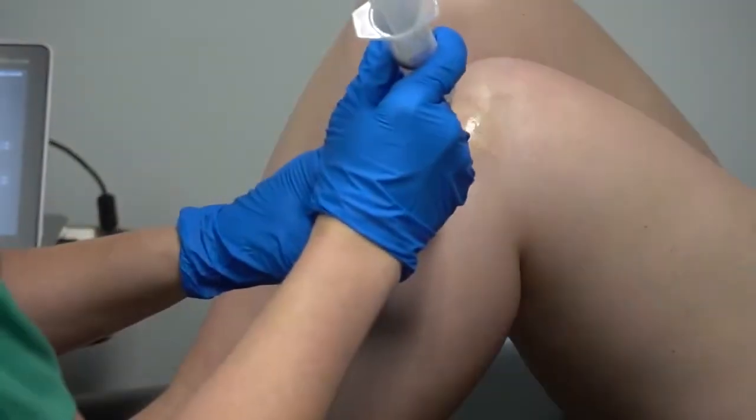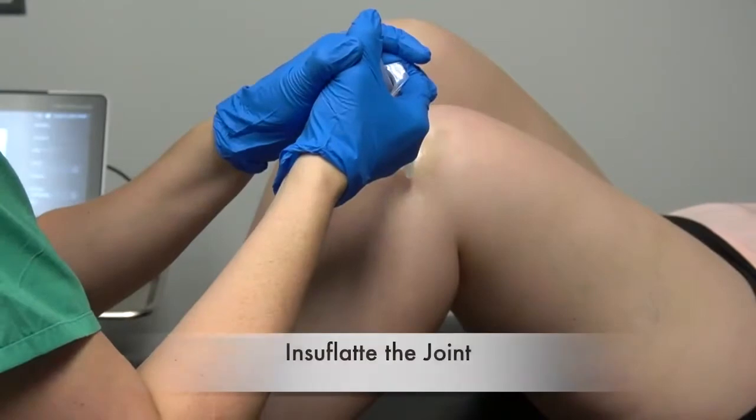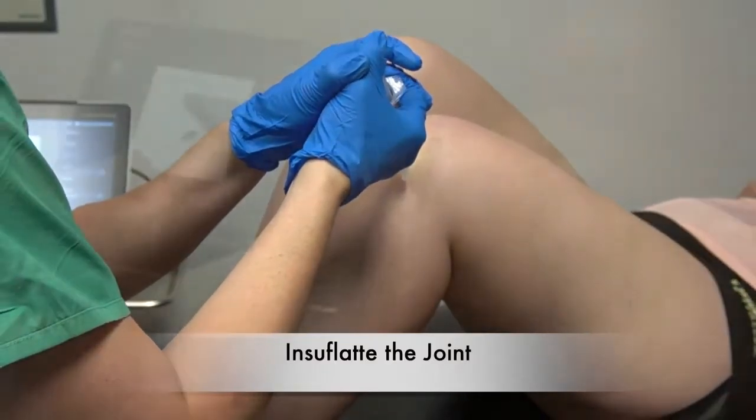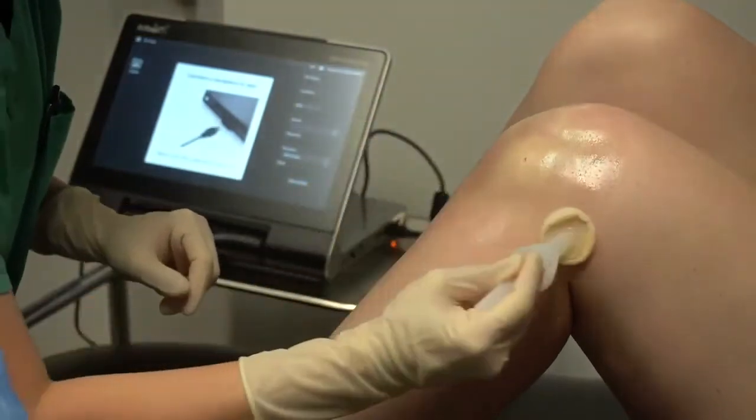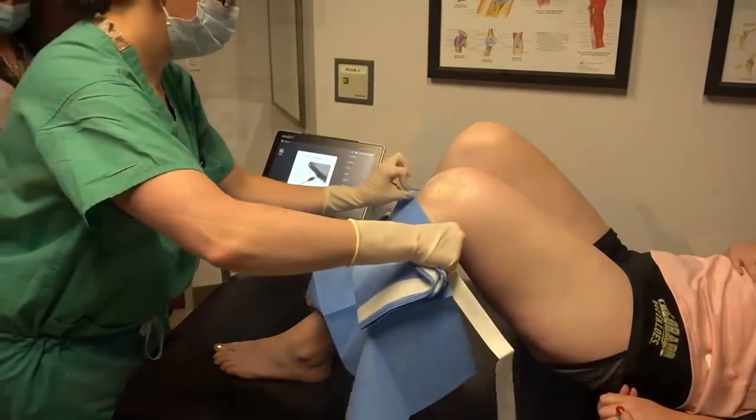Next, insufflate the joint using 20 cc's of 0.25% Marcaine without epinephrine on a 20 gauge needle. After an additional re-prep of the knee, place sterile blue drapes at the proximal tibia and distal femur to create a sterile field.